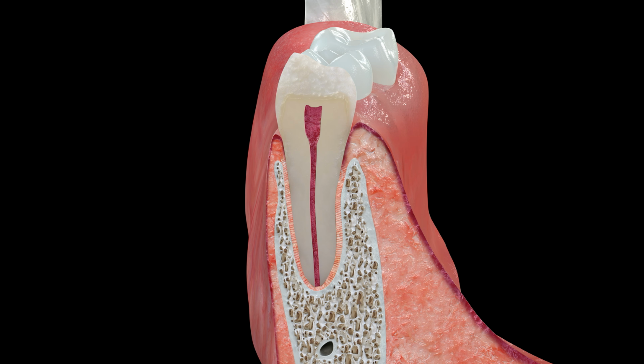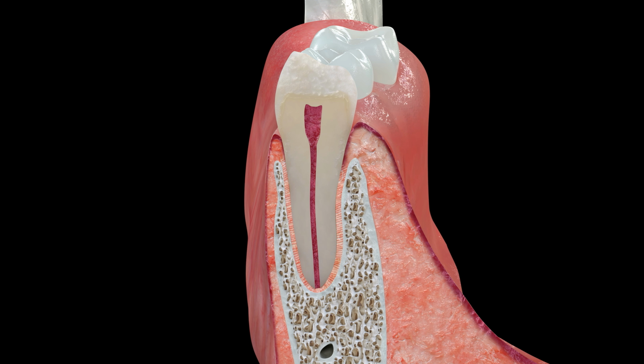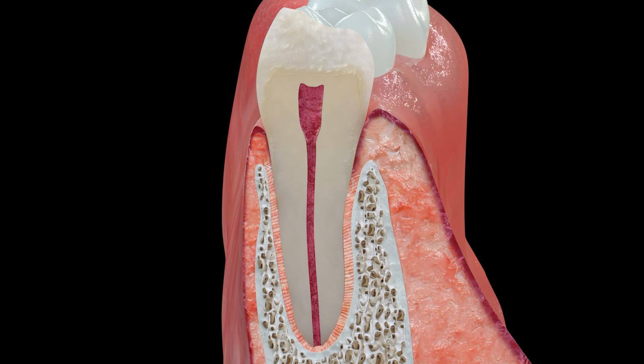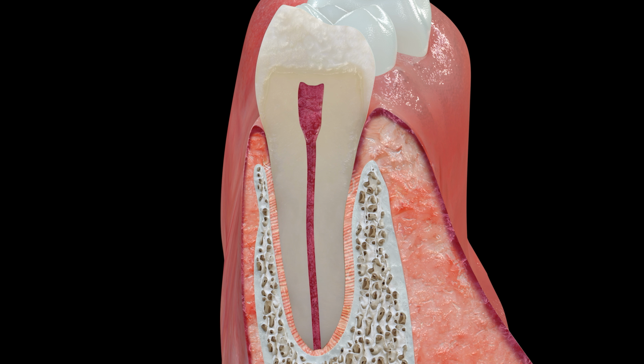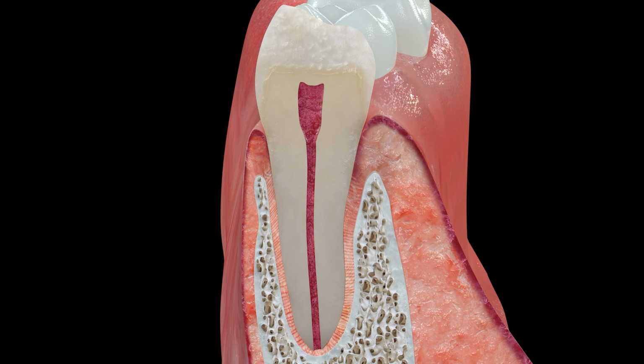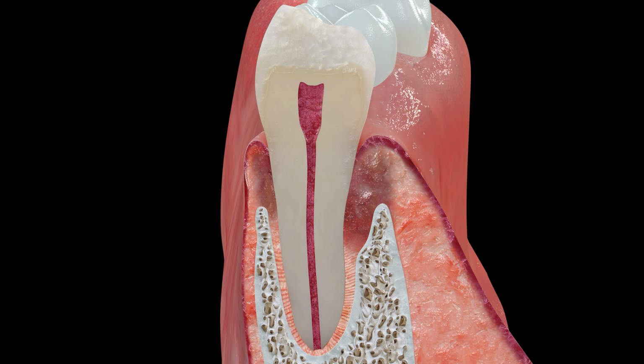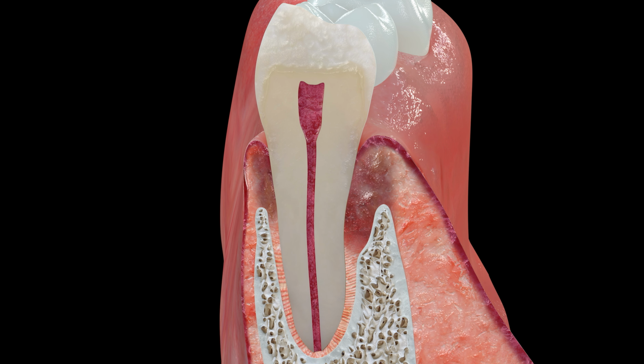In periodontitis, we observe increased pocket depth, inflammation, bleeding, and loose epithelial attachment and connective tissue fibers, leading to the penetration of the probe into loose connective tissue fibers. At this stage, bone loss and attachment loss is present, and we may observe gingival recession, as supracrustal connective tissue attachment is apical to the CEJ, and there is apical migration of the epithelium more than 1 millimeter apical to the CEJ.